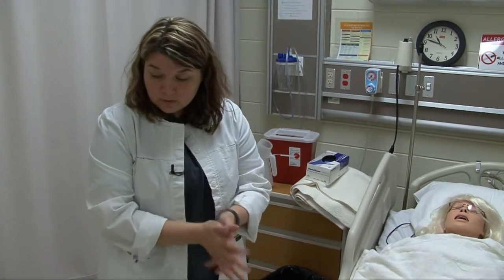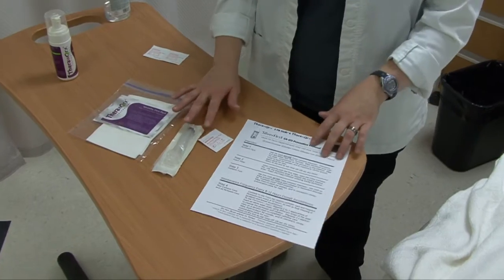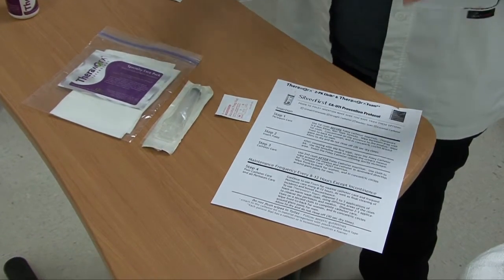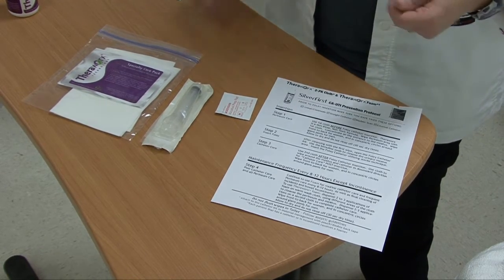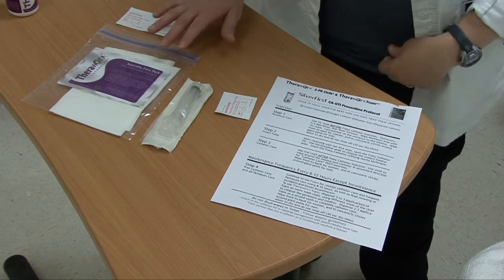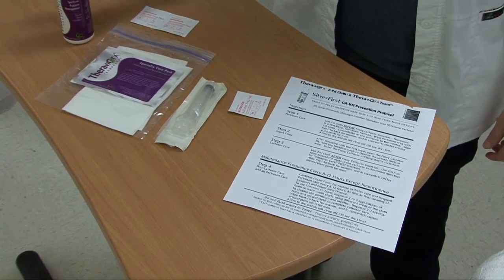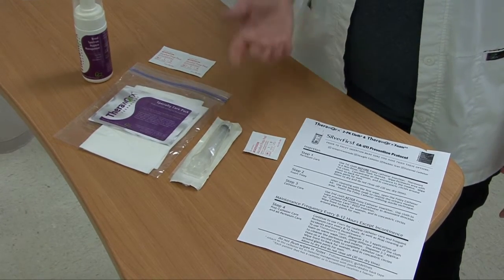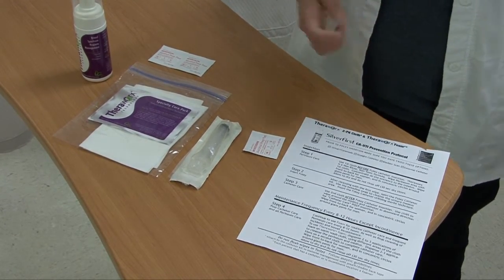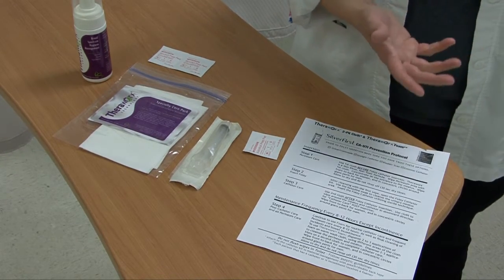Now that I've emptied the receptacle, I have some other equipment. Most agencies require catheter care within a certain time frame and specify how often you empty catheters — make sure you refer to your facility policy. Some facilities require cleaning with TheraWorks foam every 8 to 12 hours, and certainly before I discontinue the Foley I need to clean first. So I put on gloves and perform cleaning as normal.